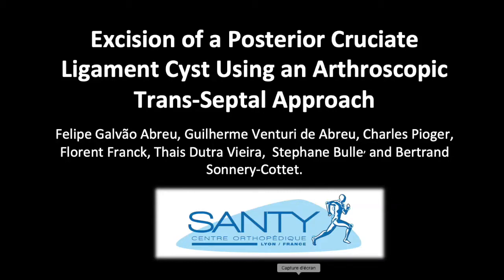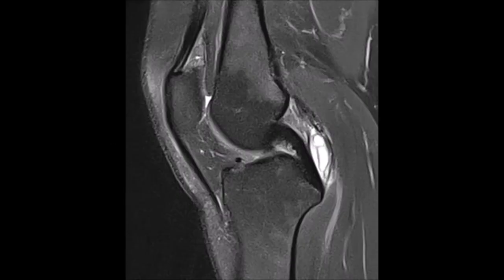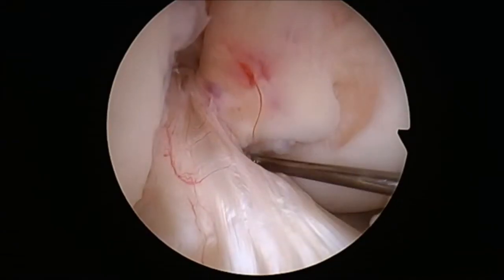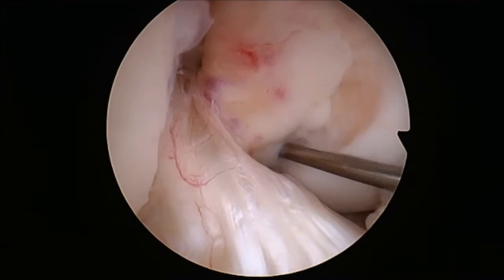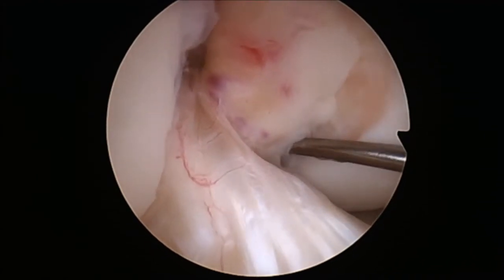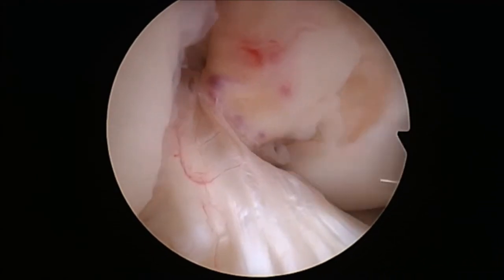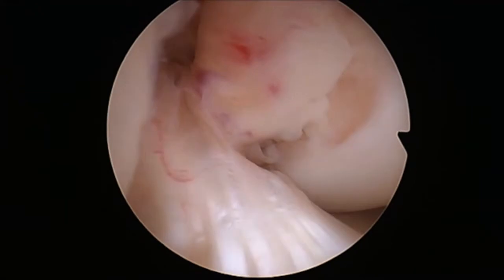PCL cyst resection through transeptal approach. The MRI image identifies a symptomatic ganglion cyst located behind the PCL. The goal of this technique is to remove the cyst safely under direct visualization.